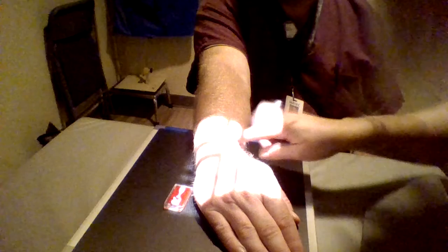Place your marker. Make sure everything's all lined up nice and straight. And take your picture. Beep. This concludes the PA, or the wrist series.